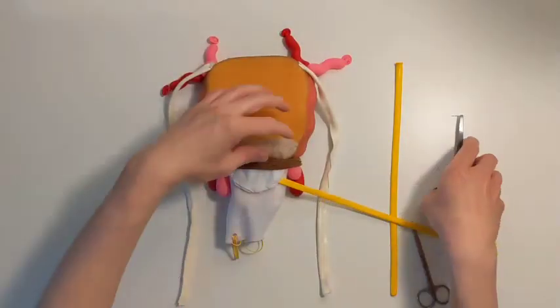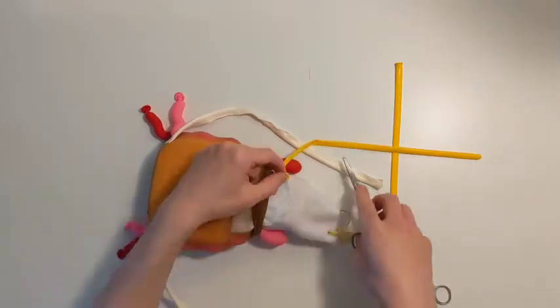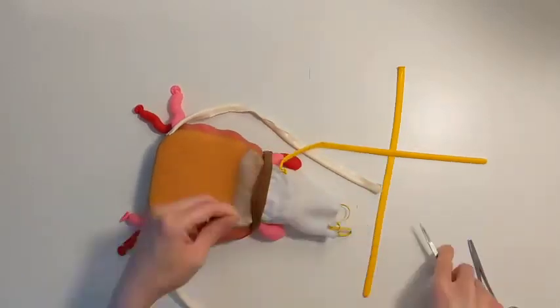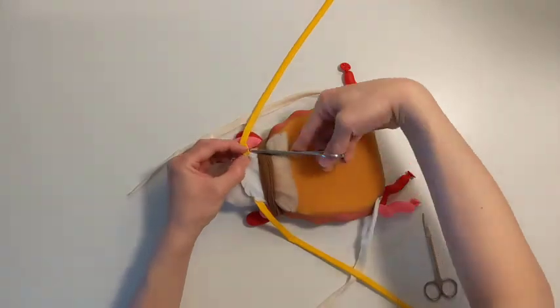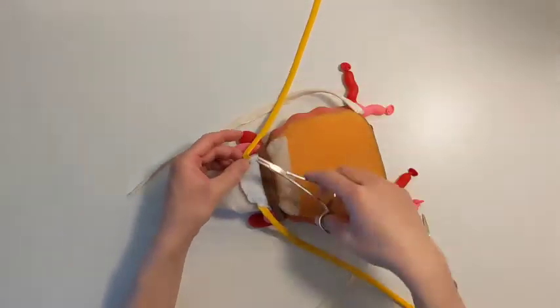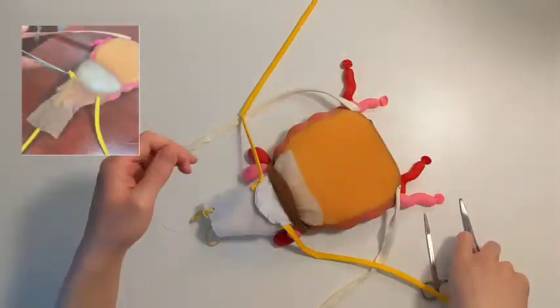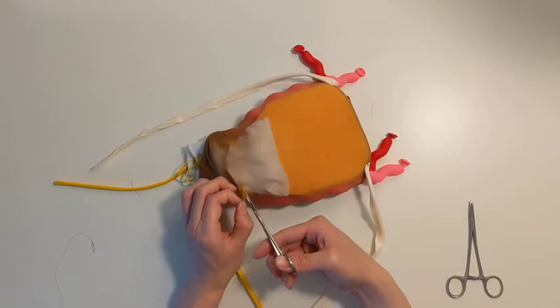The next step will be to attach the ureters. Attach the opening of the yellow balloon to the posterior and inferior area of the bladder, simulating the ureters entering near the bladder trigone. Using a suture or needle and thread, attach the balloon to the bladder similar to the way the round ligaments were previously attached. In this video, we use a suture thrown twice before tying a knot. Then this step is repeated on the other side.